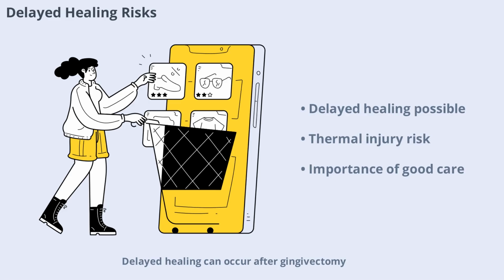Delayed healing can occur after gingivectomy, particularly with electrosurgical or chemosurgical techniques. Factors contributing to delayed healing include excessive tissue removal, thermal injury, or poor post-operative care. Recognizing and addressing these risks early helps ensure a successful recovery.